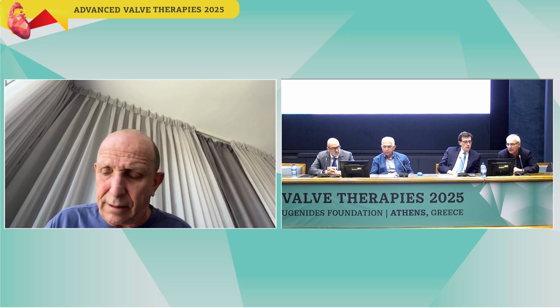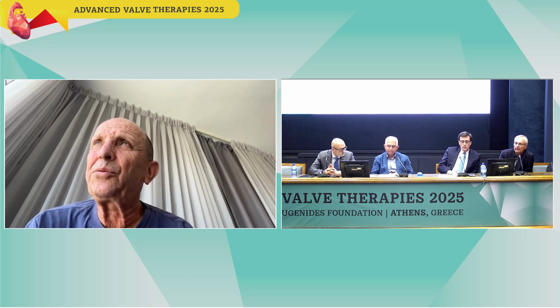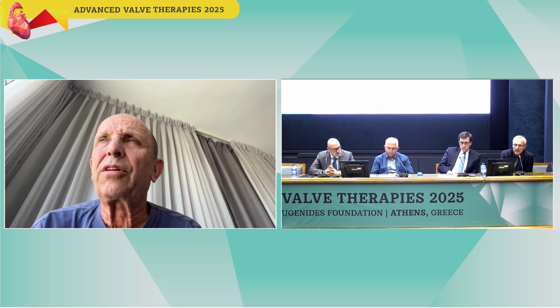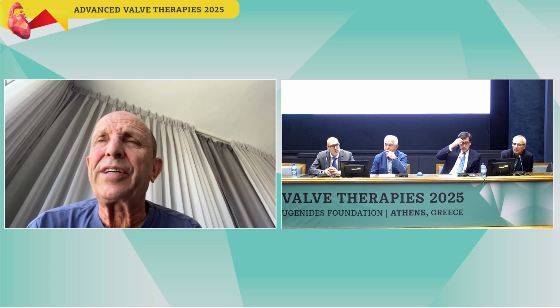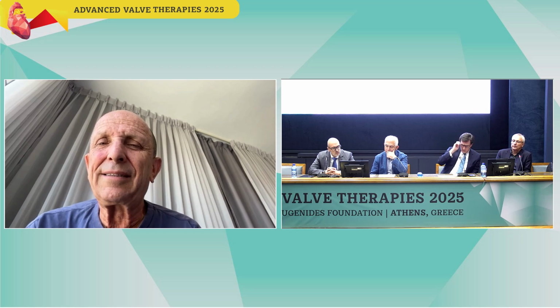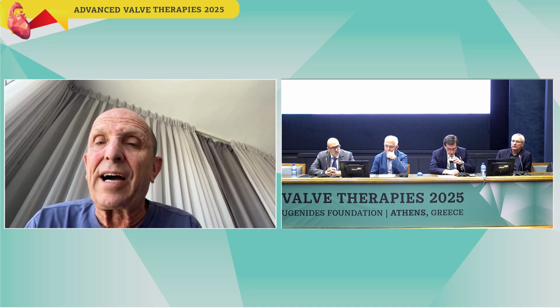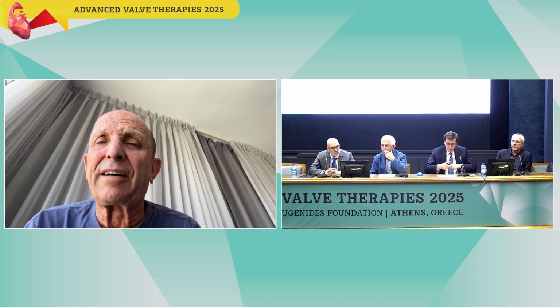Now, this is a very important question. I think that we went already to what we call patient-tailored therapy. And I think that the need for a supraannular valve in order to prevent PPM, patient prosthetic mismatch, depends on the patient, whether it's a small patient or a bigger patient, whether young or not, whether you're going to see a need for a future TAVR procedure.